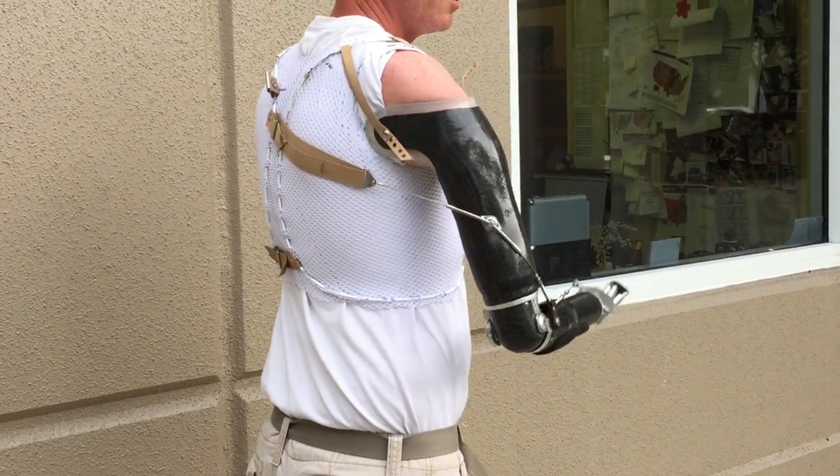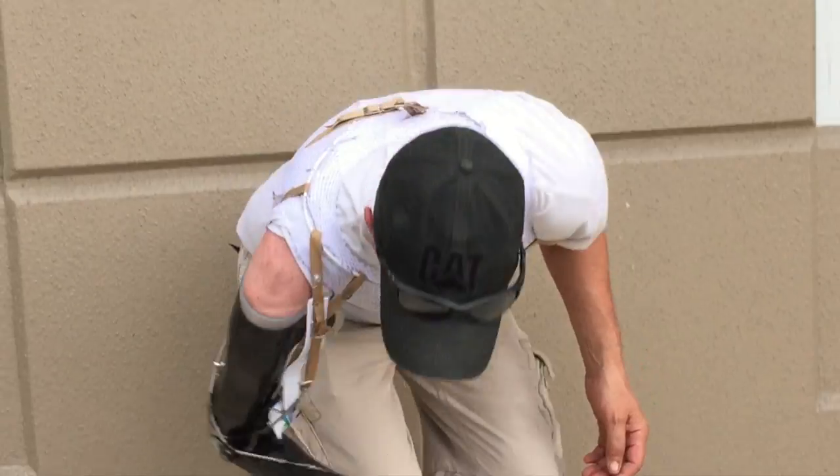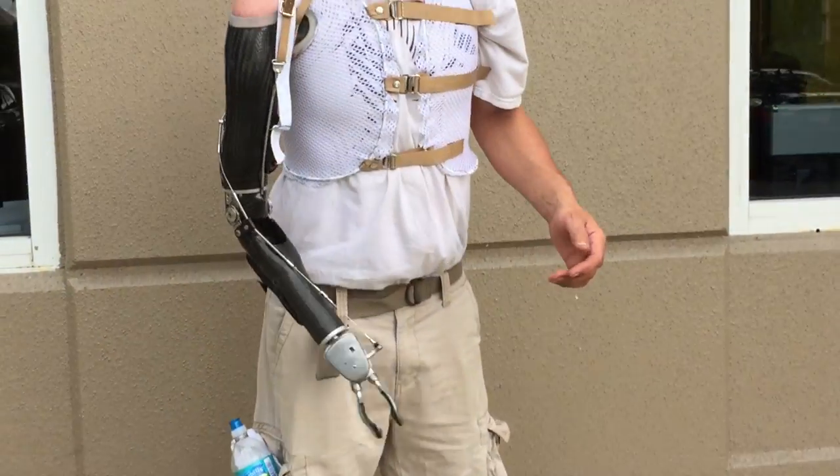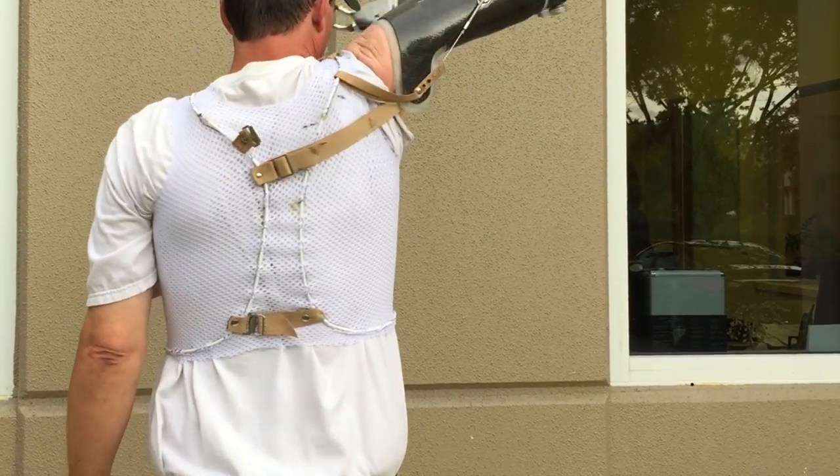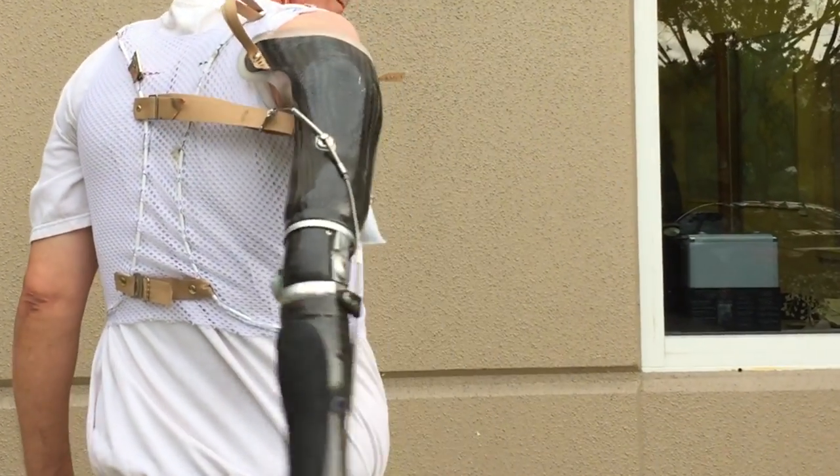Traditional strap harnesses offer limited control capabilities in normal daily positions, such as when bending forward. But the figure 8 vest harness provides increased responsiveness and precision control of the terminal device and elbow units in all positions.